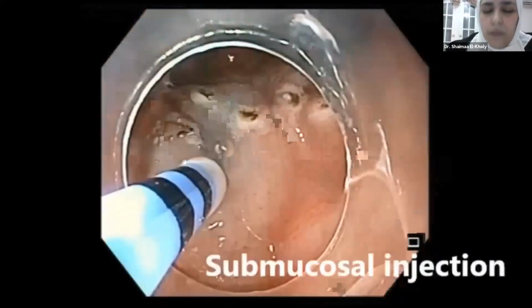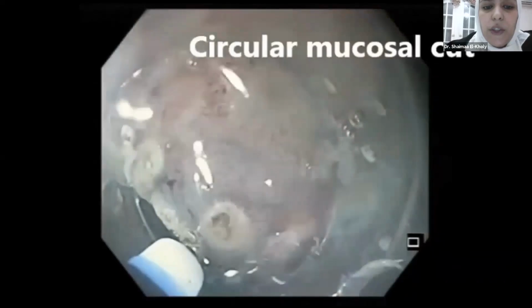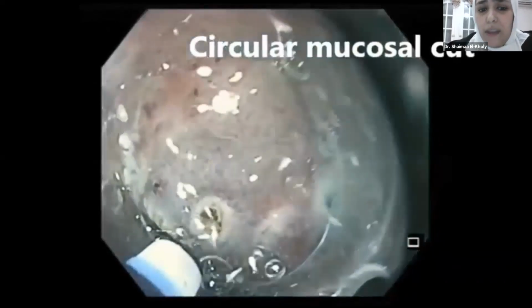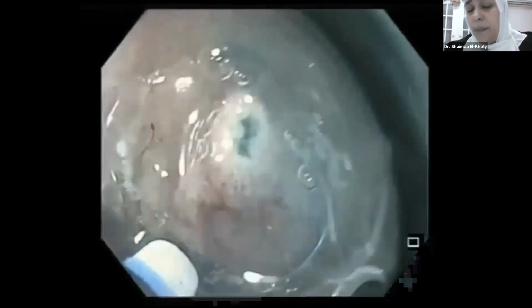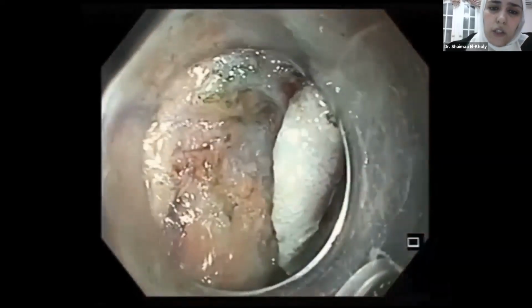As you can see, first injection, of course, and then with the circular incision. As you can see here, the circular incision, it's a very nice demo because you just cut outside the marking so that you get a very good safety margin. And you can see here, after the circular incision, we start to go beneath the lesion.